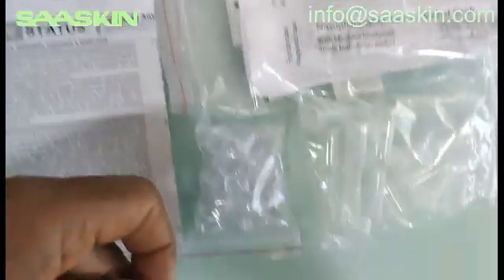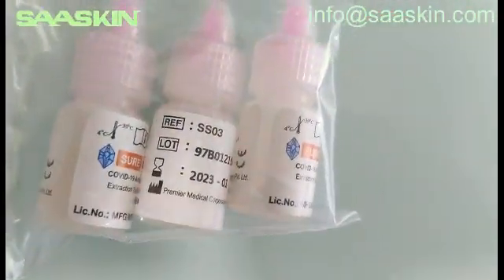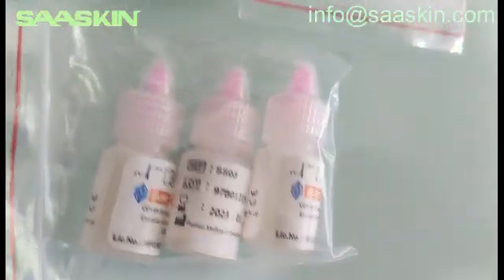And you can see the buffer liquid — three packs of buffer liquids. And you can see the test cassettes — 25 test cassettes.